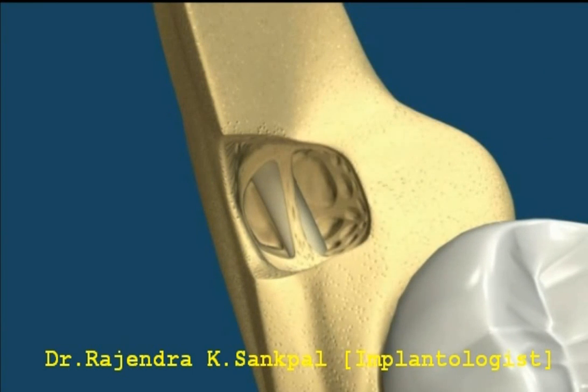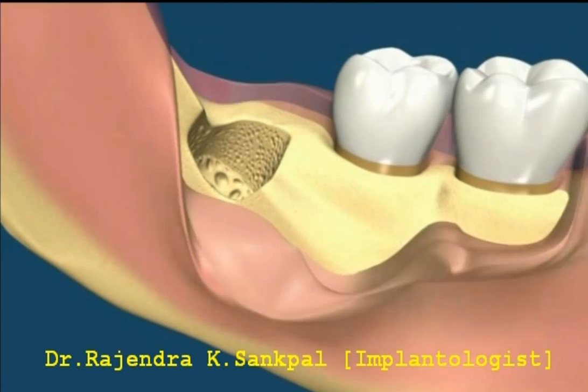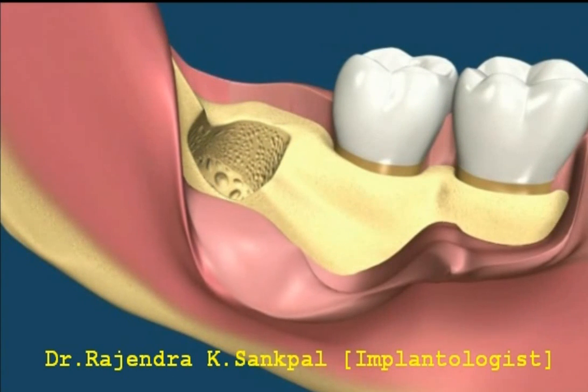The flap is repositioned and sutured into place.